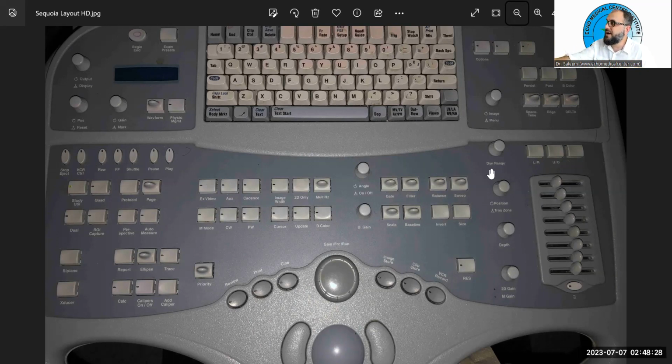To have better image quality in specific areas, for example if I want to look at a structure that is a liquid or fluid-filled area, like a chamber of the heart which has blood, the urinary bladder which has urine, the gallbladder which has bile, or a cyst, which is just fluid, we want to decrease our dynamic range. It will give you the best image quality.